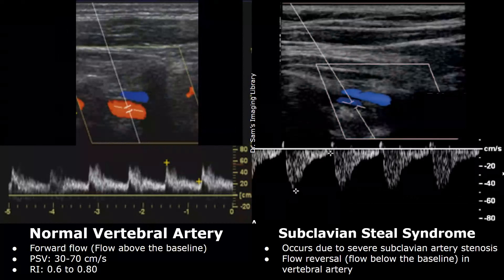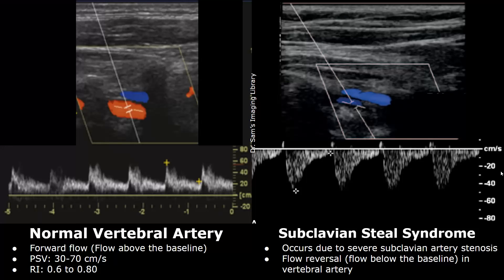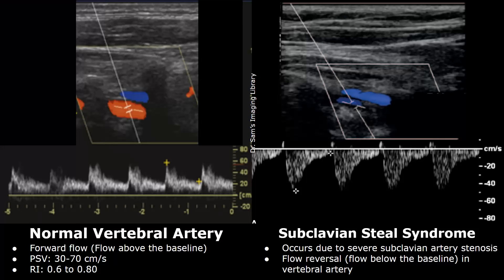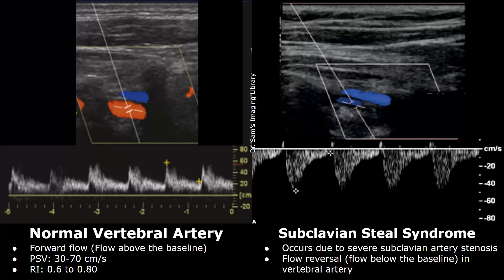Subclavian steal syndrome can occur in cases of severe subclavian stenosis or occlusion. Subclavian artery blood flow to that arm is significantly reduced. This can lead to a change in blood flow in the nearby vertebral artery. The vertebral artery will undergo flow reversal, which makes it look like blood is stolen from the vertebral artery and goes into the subclavian artery. Hence, we have the name subclavian steal syndrome.